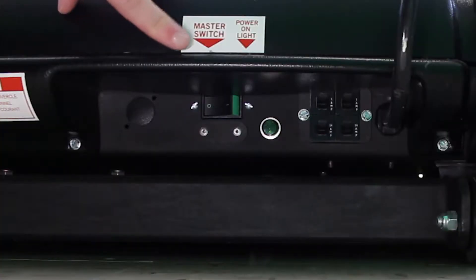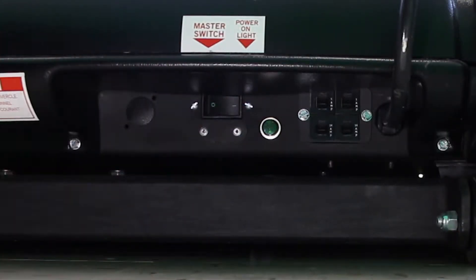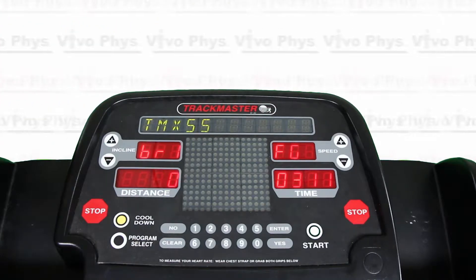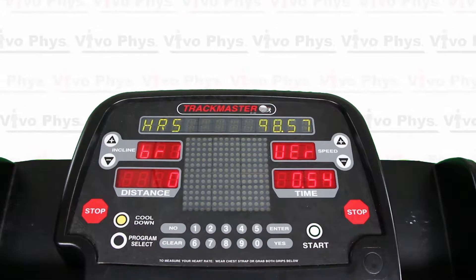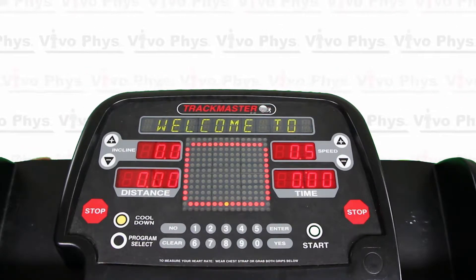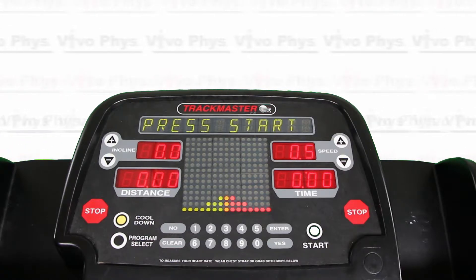In order to turn on the treadmill you simply have to hit the switch in the back of the treadmill itself. You're going to see a bunch of different things starting to flash on the screen. Eventually it's going to finish and it's going to show that it's ready to go, which is right there.